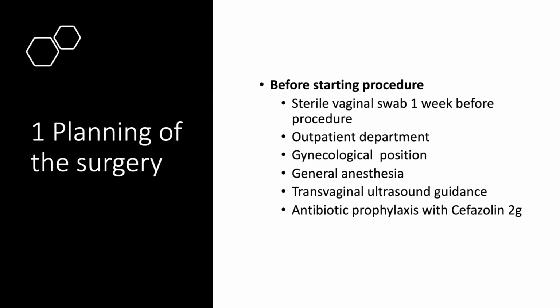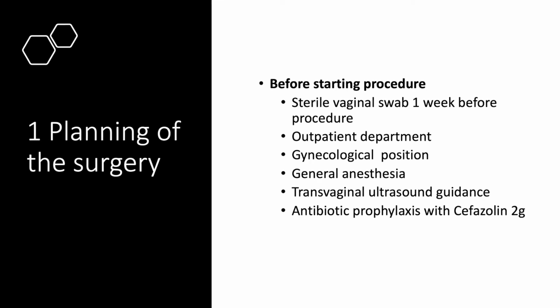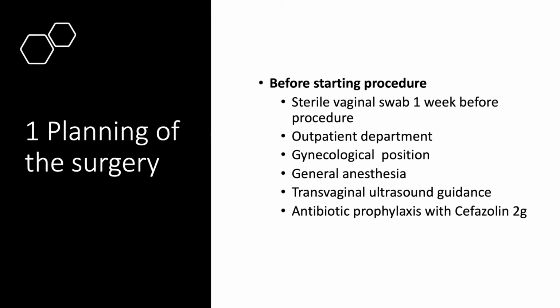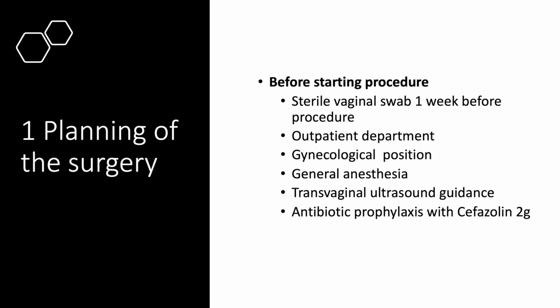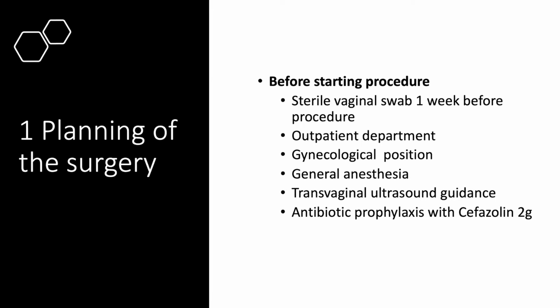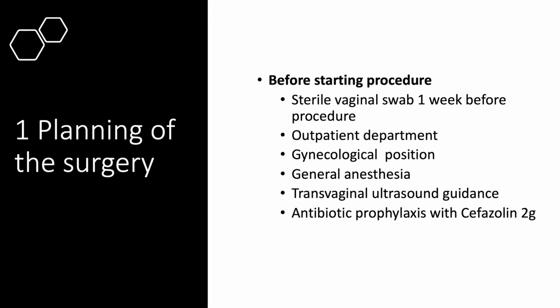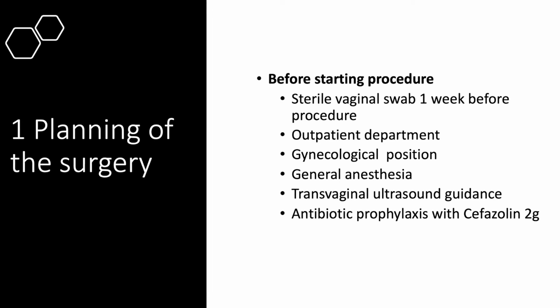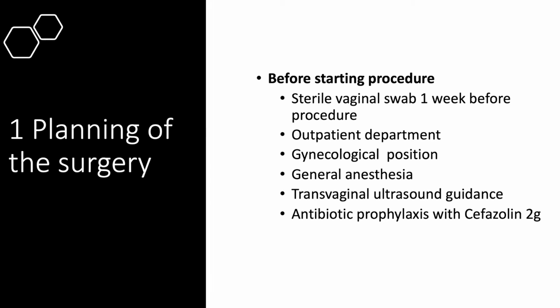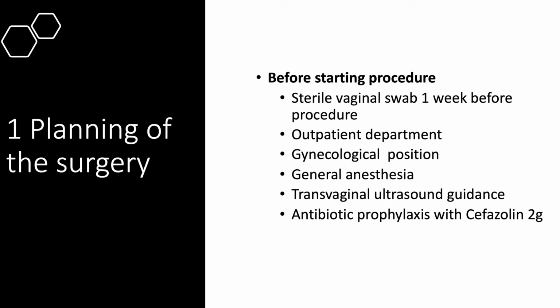The intervention was performed in an outpatient department in gynecological position by a trained gynecologist under general anesthesia and under transvaginal ultrasound guidance. General anesthesia is not compulsory, but we prefer it because it ensures that the patient does not move during the procedure. We choose to administer cefazolin 2 grams antibiotic prophylaxis to prevent post-sclerotherapy infections despite the limited evidence to support it. Indeed, post-procedure infections may be underestimated in the literature.